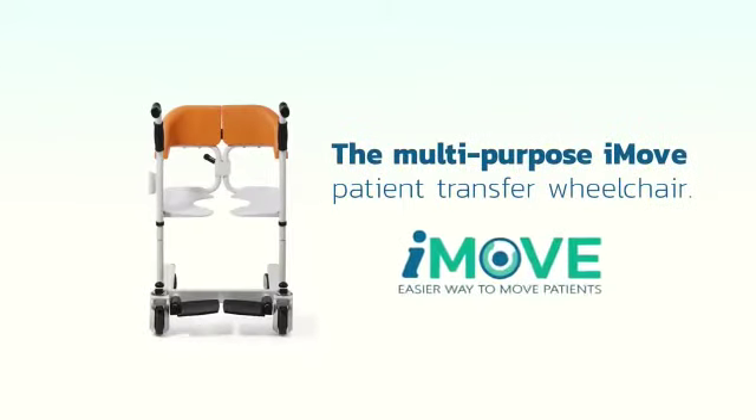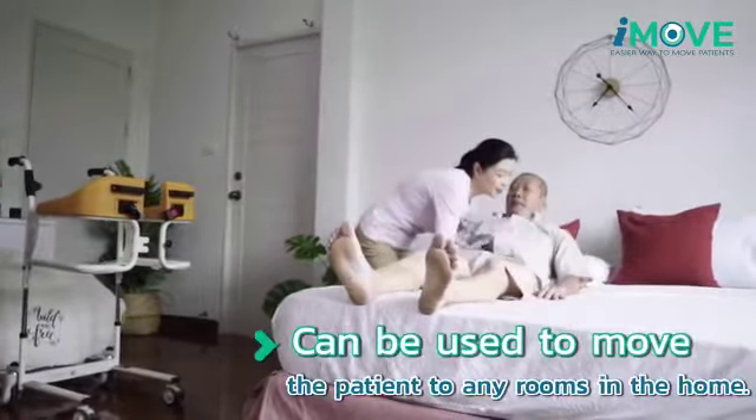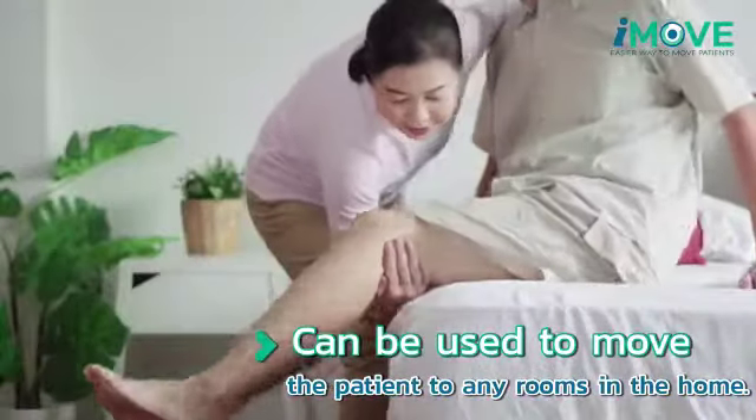Today, Synergy Wheelchair would like to introduce you to the Multi-Purpose iMove Patient Transfer Chair. The Multi-Purpose iMove Patient Transfer Chair was designed to help in the caring of patients on a daily basis.